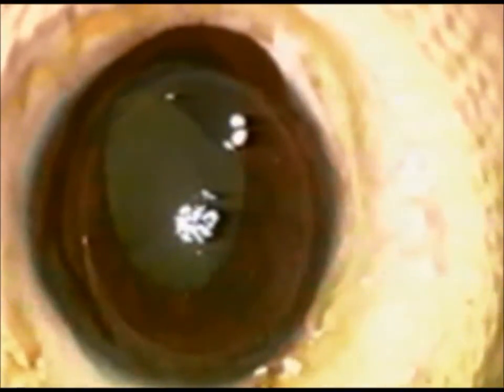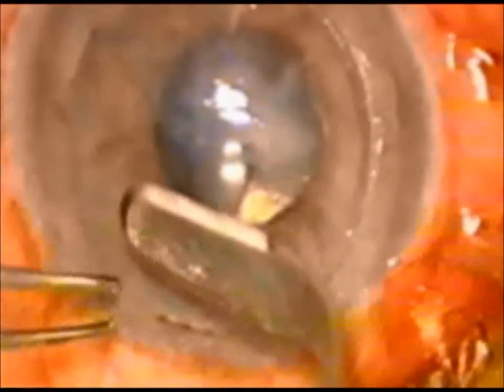We can see that we have achieved our objective of getting a button with a full-thickness central eight millimeter disc and a peripheral flange of two millimeters. Now we proceed to the creation of the complementary host surface. A partial-thickness trephination of seven point five millimeters is done in the host, and a lamellar pocket is created up to the limbus all around with a crescent blade.